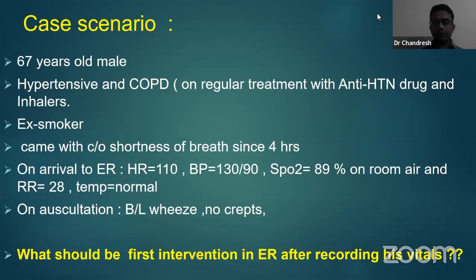Maybe many of you might think, okay, because the patient's oxygen level is around 89 and the patient is breathless since last 4 hours, the first basic reflex we have seen in our staff is they will start oxygen. And let's see how it goes.